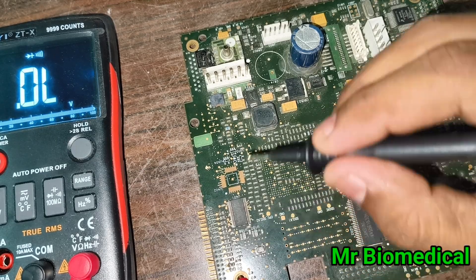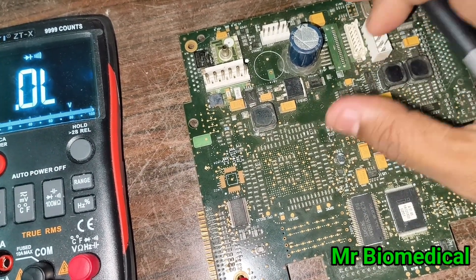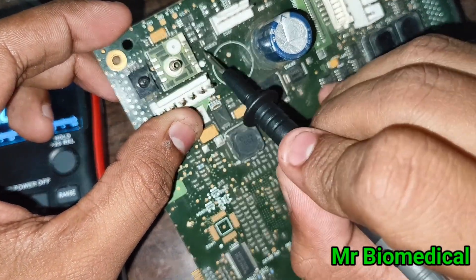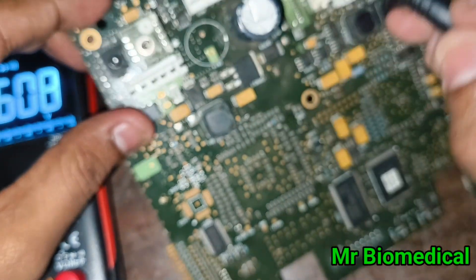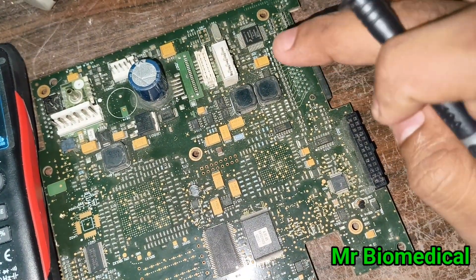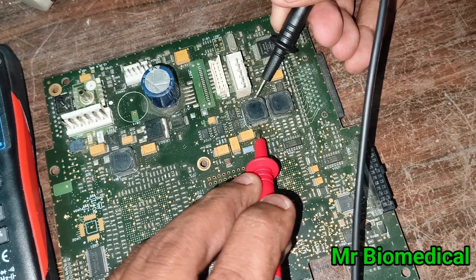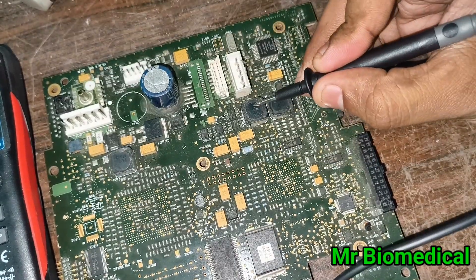Remember that inductor pins are not connected to the ground pin. Moving back to capacitors — this is a normal capacitor, you can see the CR designation, and it's looking good. Now let me talk about the inductor. This is the inductor.